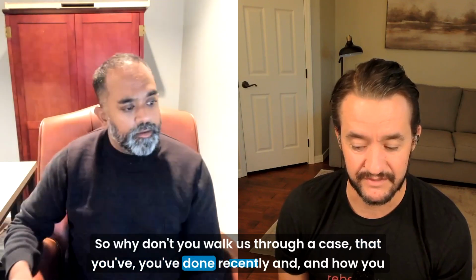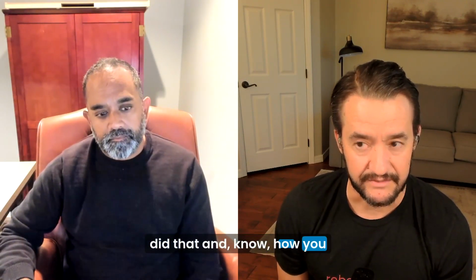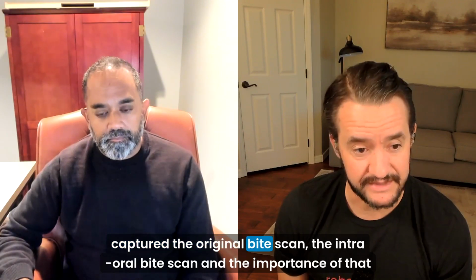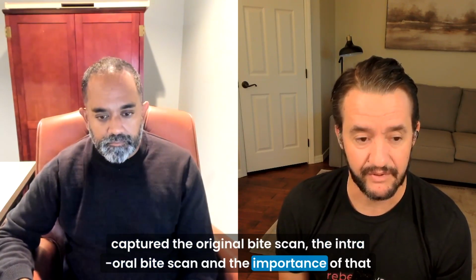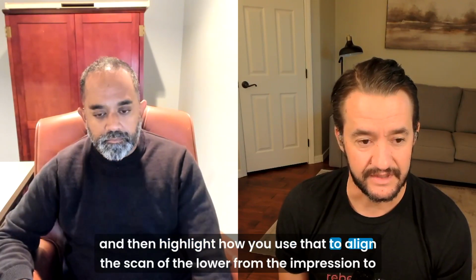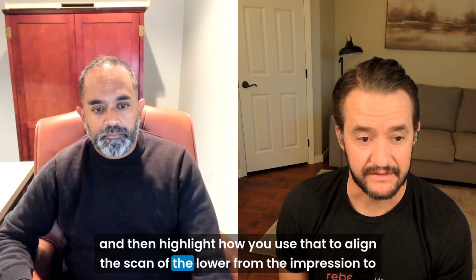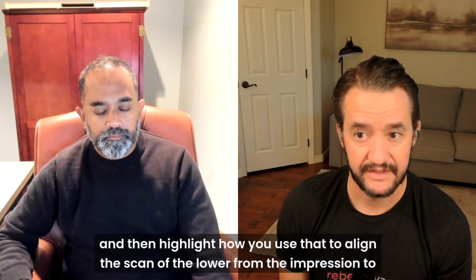That you've done recently, and how you did that, and how you captured the original bite scan, the intraoral bite scan, and the importance of that, and then highlight how you use that to align the scan of the lower from the impression to the original scan.